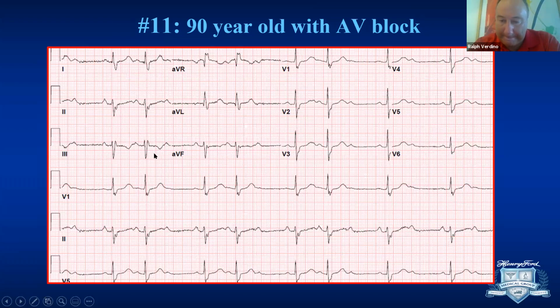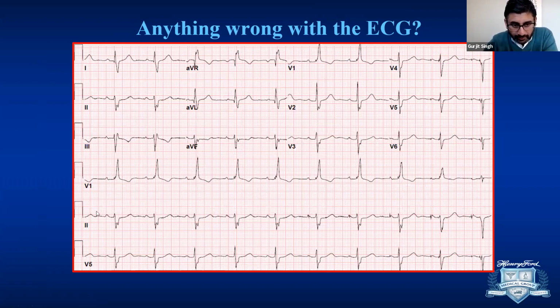Yeah. Okay, so I think I'll take over. So if you look carefully, obviously, if we look at lead V1, the patient is in sinus rhythm, upright P waves in leads 2, 3, aVF. And then let's look at the telemetry lead 2. If you keep going on, the patient is in sinus rhythm, and then the 1, 2, 3, 4, 5, 6th beat has this pacing spike coming on top of the P wave, right? And then at the last 2 beats, the pacing spike comes before the onset of the P wave.